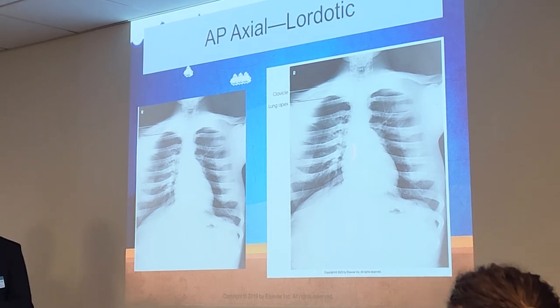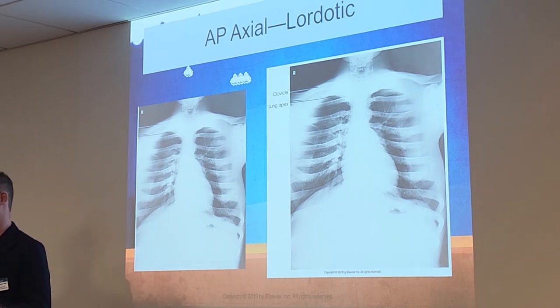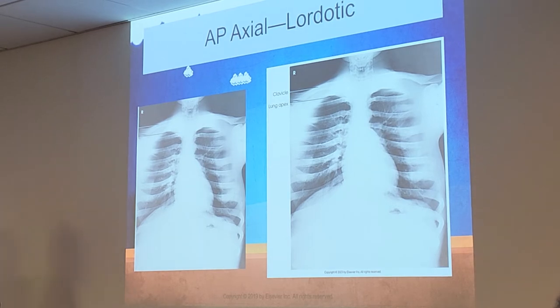I've been seeing this x-ray for so many years now. I'm like, has anyone ever done another lordotic chest in their life? That's like the only picture. You put it in Google, it's the first picture you see, typically. Are those common? No, that's what I'm saying. They're not done much at all anymore. Very uncommon. Once again, because of the advancement in technology, with the digital systems, you can pretty much just get a good analysis of the apices on a regular AP or PA. You don't really need to do these anymore.